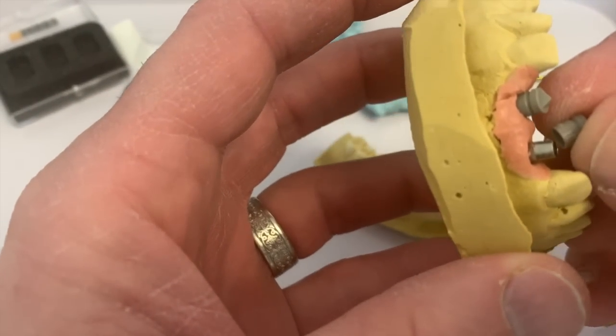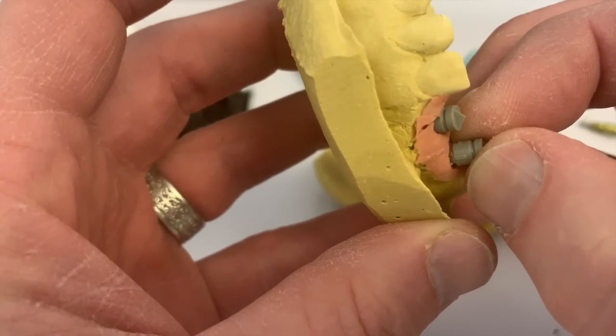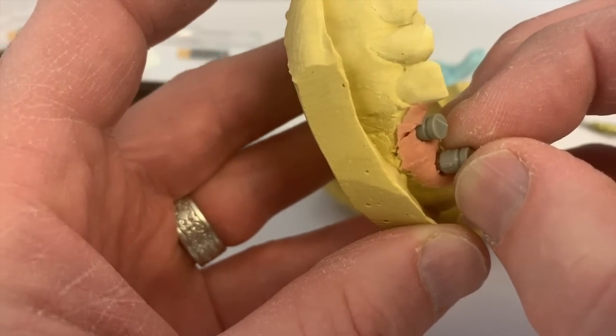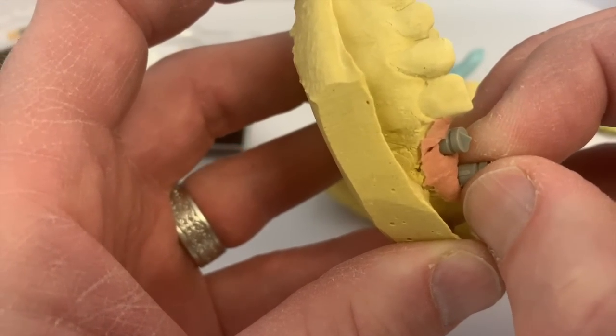All right, so I'm just gonna line this up. Let's get that camera to focus. So see how it's not lined up there? I could force that to place, and since this is plastic, it would mold, it would bend, it would deform and it would fit. But if I gently set it on there and twist until I feel it, you can actually feel it drop in there.